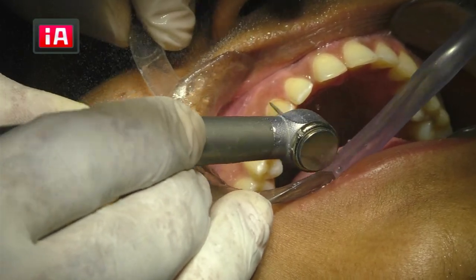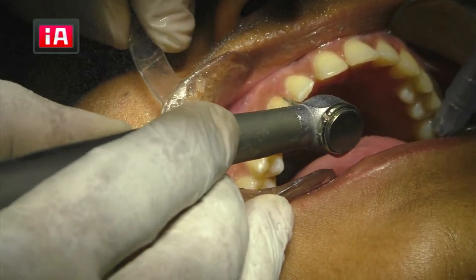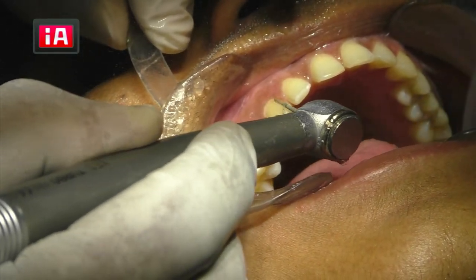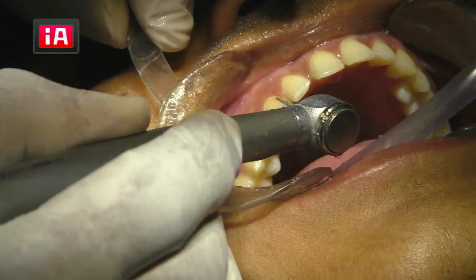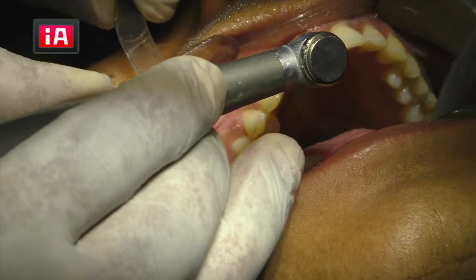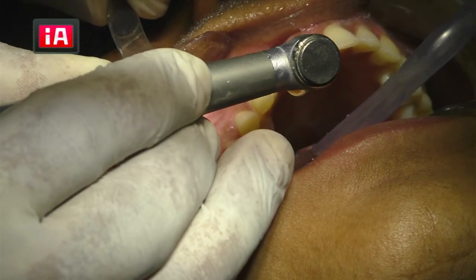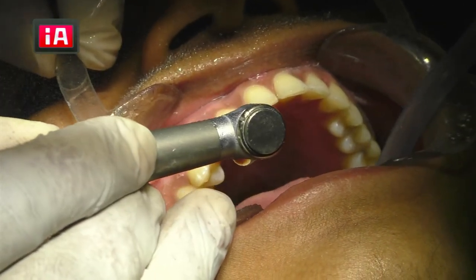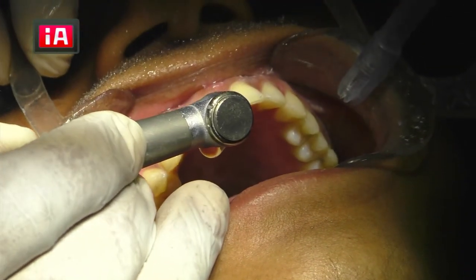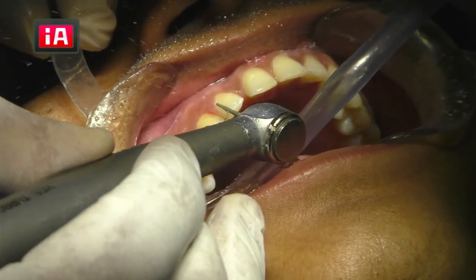Approximately you make a ring, and there should not be any undercut. Otherwise, what happens? If there is any undercut, the veneer will not go. Okay, the situation should have a nice contouring. And now I'm going to do a margin for the lateral. Margin for the lateral.